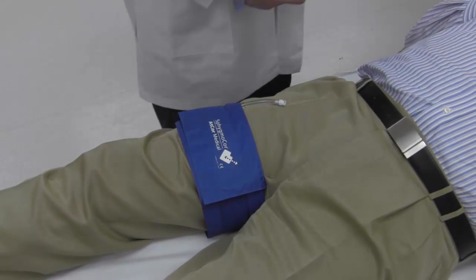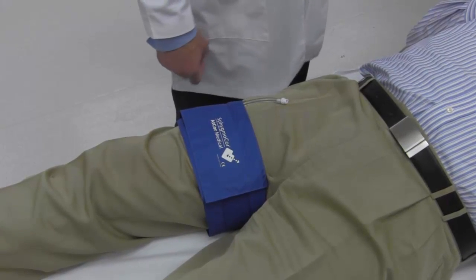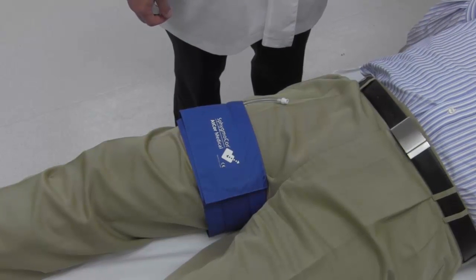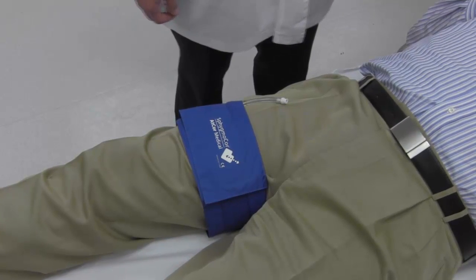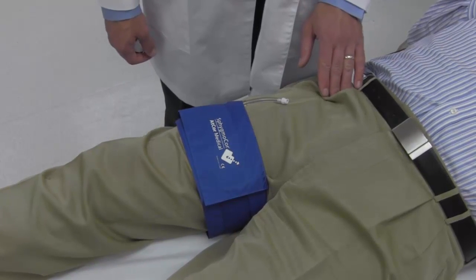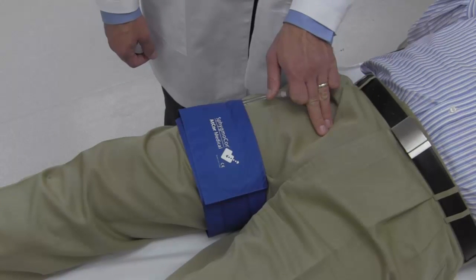Finally, measure the distance in a straight line from the palpated location of the patient's femoral pulse to the top of the thigh cuff. The femoral pulse is best felt at an angle approximately 45 degrees inward from the hip bone by the groin or crease of the leg.